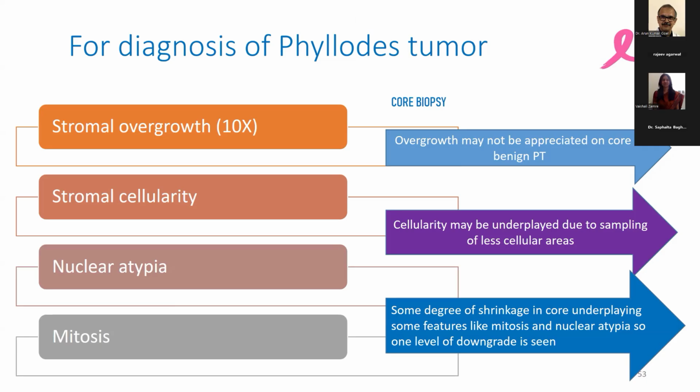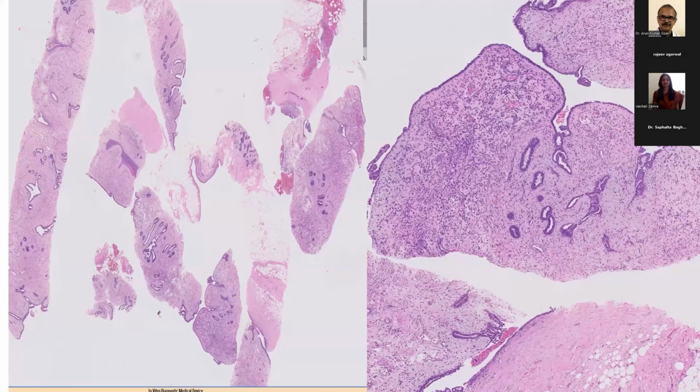For want of time, I'll just show you one case. Now, this is a nice core biopsy. And you see, so normal fibroadenoma showing lots of this collagenous stroma. Here what is happening, you're seeing blue areas. These blue areas are the cellular areas. And you see, this is a representation of a leaf-like space. We call it fragmentation, where you have one core with 2 sides covered by epithelium, so it's a leaf. So that's the kind of thing you have.